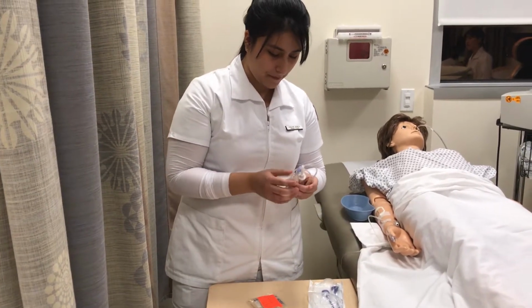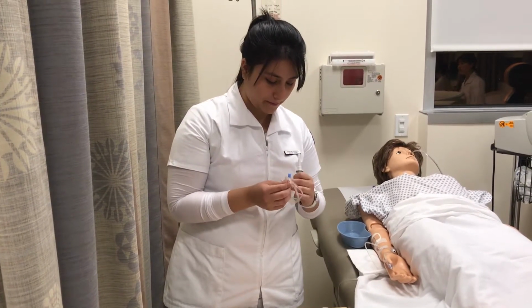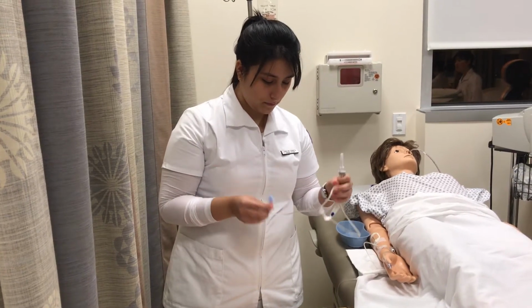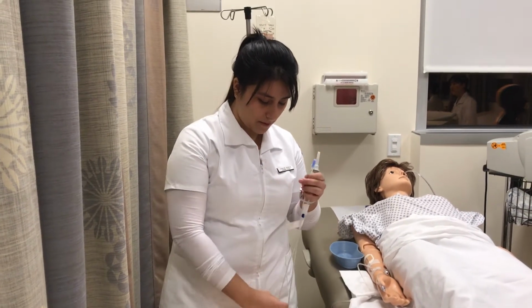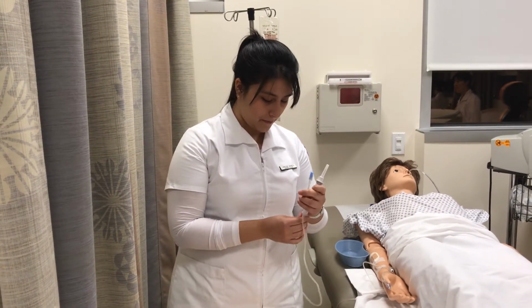Making sure, like I said, it's labeled. I'll be keeping it above my waist for sterility.